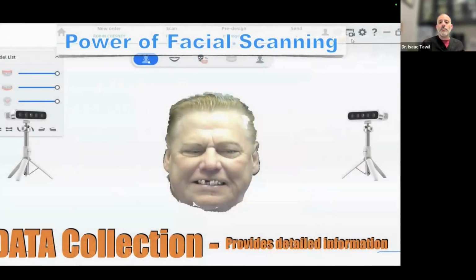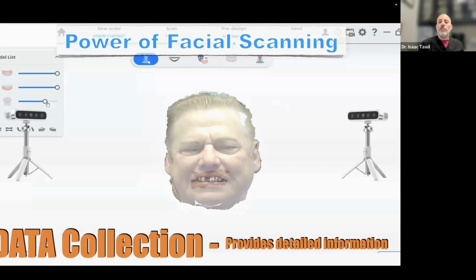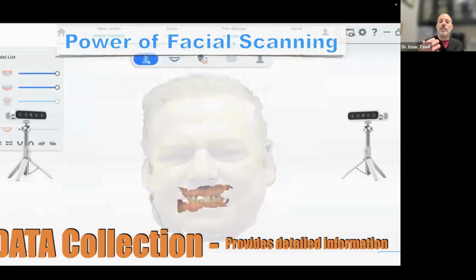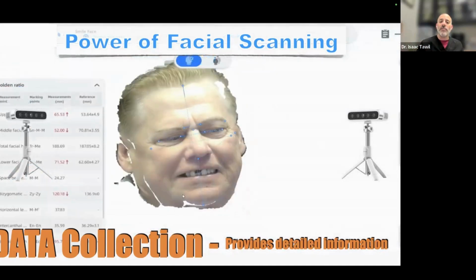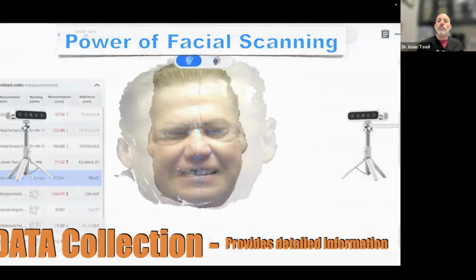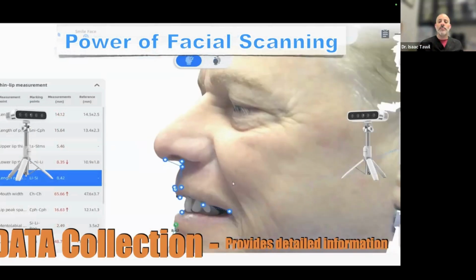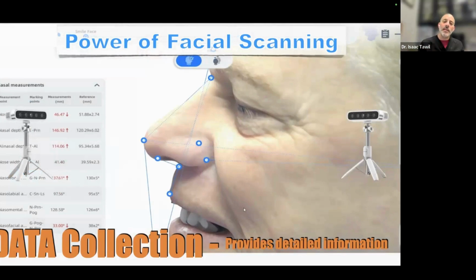So, for example, for this patient, we can incorporate all the different phases for him in one file. We can have a facial scan that is three-dimensional. We can then also include the intraoral scan and have that match together. We can crop out his smile and use his intraoral scan smile. We can overlay the CBCT and have this all in one file. And in the end, we can get numerical data: where his line angles are, where our tragus is, where his Frankfurt horizontal plane is. We can look at all these different aspects, interpupillary diameters, and we are able to now hand this over to the dental technician for a better evaluation of the case.